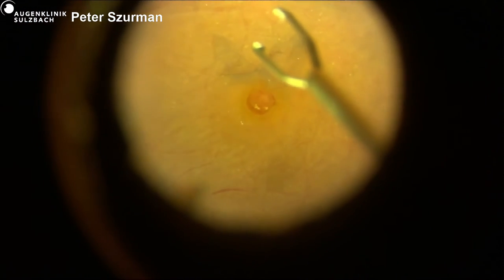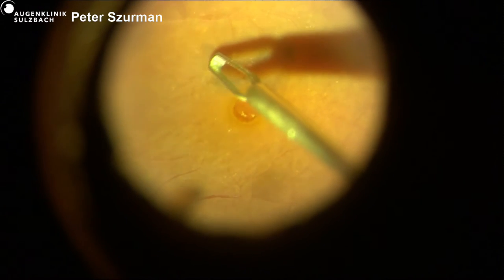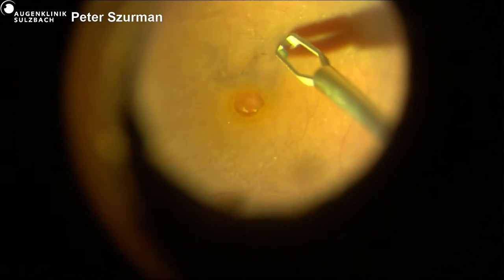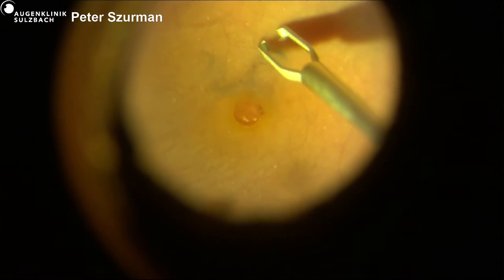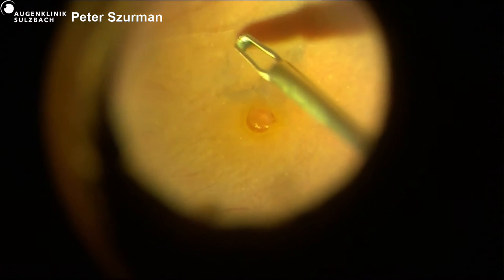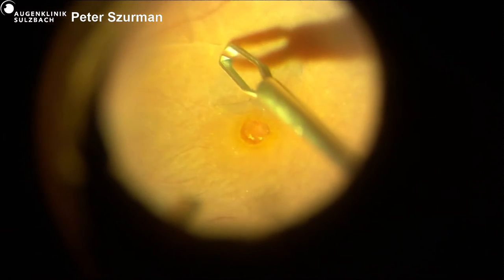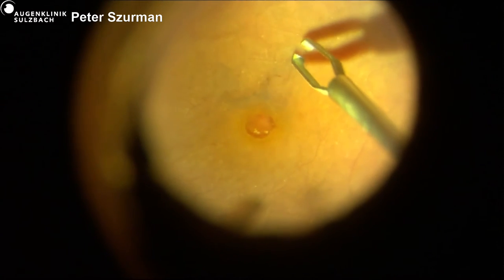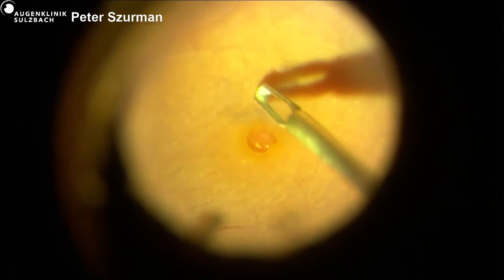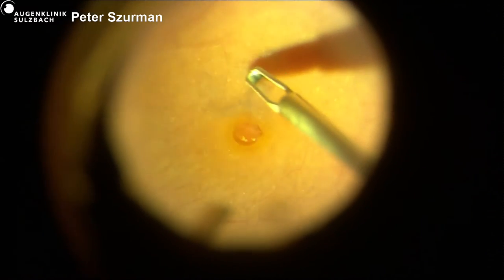You did not, Claudio, you did not stain the vitreous with triamcinolone? Yes, before, yes. Tell me, do you try to lift, if you find cortical vitreous, do you try to lift it up to the periphery? Or only at outside the vascular arcade? I perform a core vitrectomy and I stop at the arcade. Vascular arcade. Yes. Are you using a contact lens?